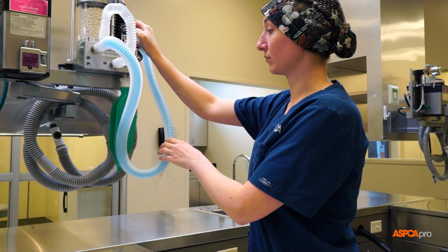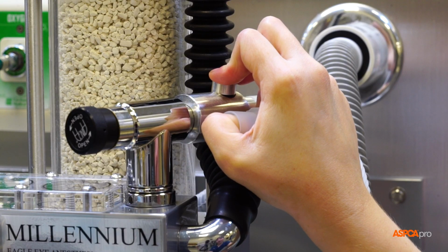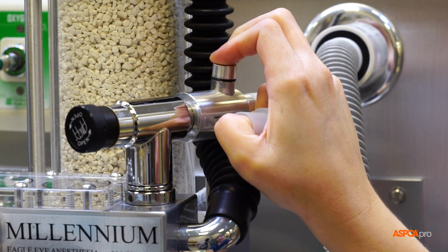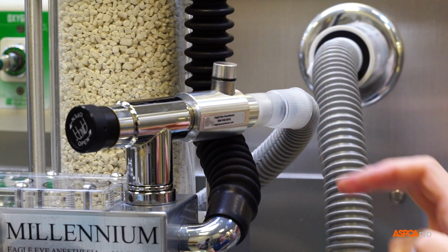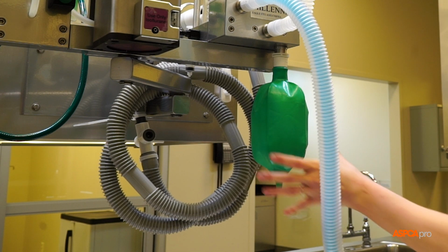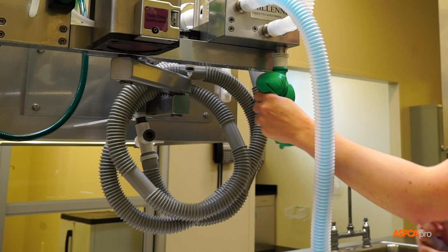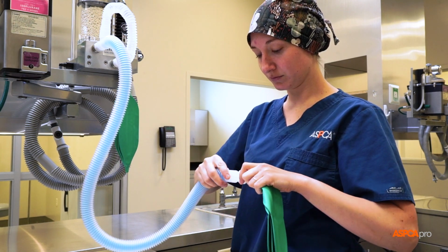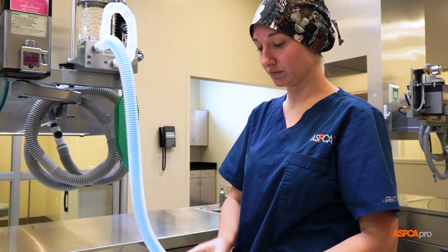At the end of a test, always release the pressure in the circuit by releasing the occlusion valve or opening the APL valve slowly. Then evacuate the reservoir bag through the scavenger system, only then removing your hand from the patient end. Removing your hand first can cause absorbent dust to enter the breathing hoses and potentially enter a patient's airway.